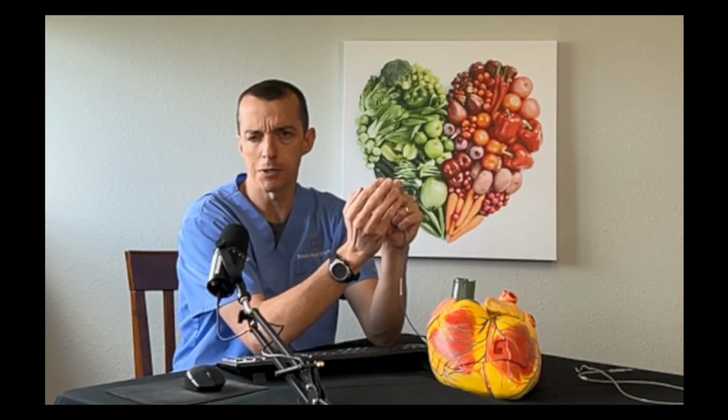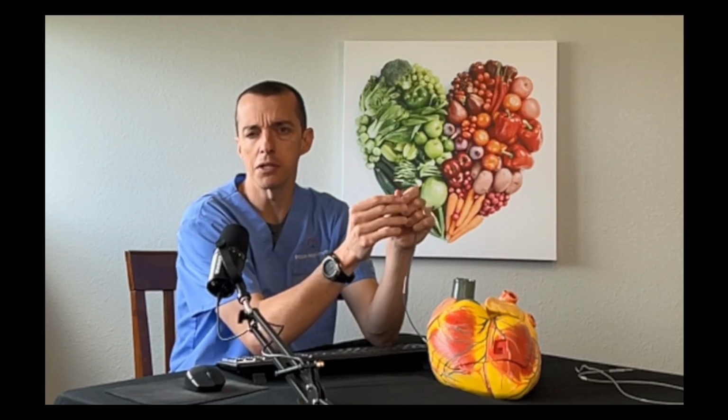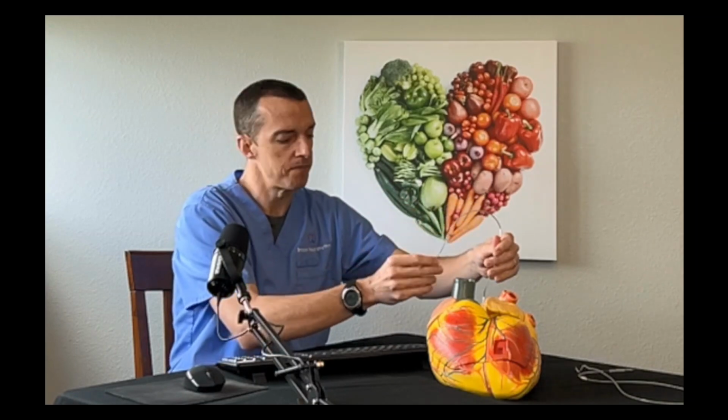And if the pacemaker's pacing, you'll get a stimulation that's uncomfortable. So typically the patient's aware of it, they're calling and complaining, or they're presenting to an ER. I mentioned this already, pacemaker stimulation. We'll go into that a little bit more, but some people actually can feel the pacemaker firing off, and that has to do with the amount of voltage. Typically, that's in our bigger pacemakers, the ones with three wires, but that is a, quote, complication. Thankfully, that one's an easy one to fix.